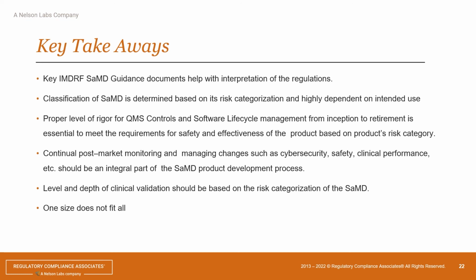And in terms of validation, it's again all about the risk categorization. We talked about clinical validation, but it also goes with usability, IEC 62366, and with how connected you are, for example, with your cybersecurity risk assessment, which you want to take under your risk management, whether I'm doing cybersecurity threat modeling, a usability failure mode and effects analysis, an application FMEA, or working from my design.